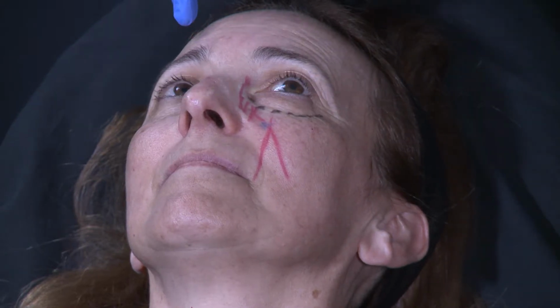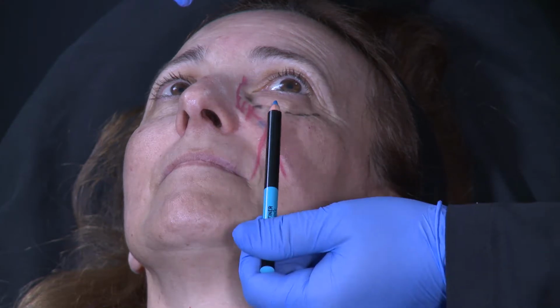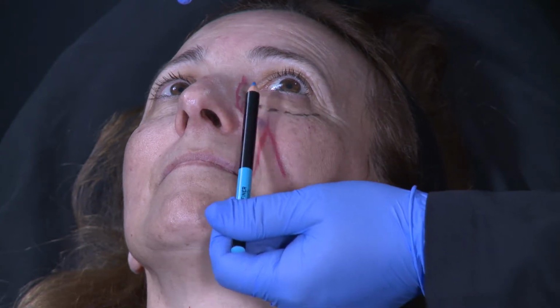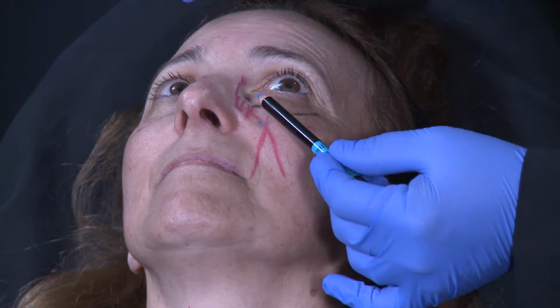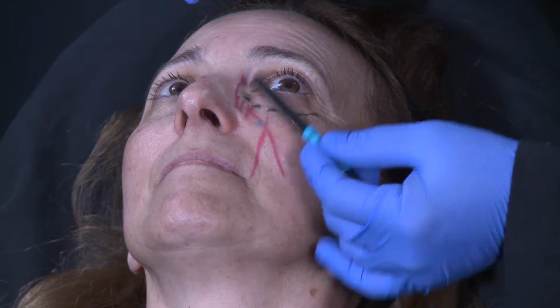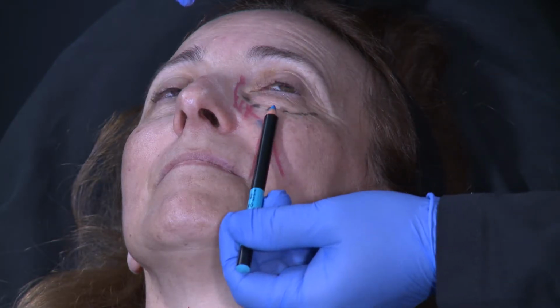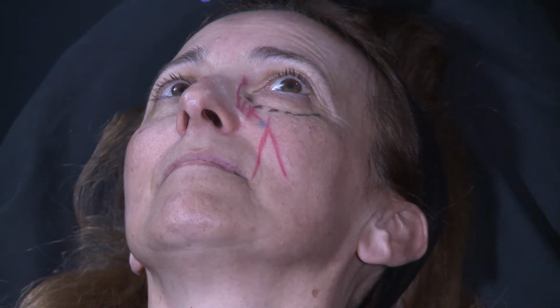So if I summarize, here in the middle part of the mid-pupillary line, there is all the dangers: infraorbital nerve, facial vein, angular artery, and on the lateral side of this mid-pupillary line, you have no danger.